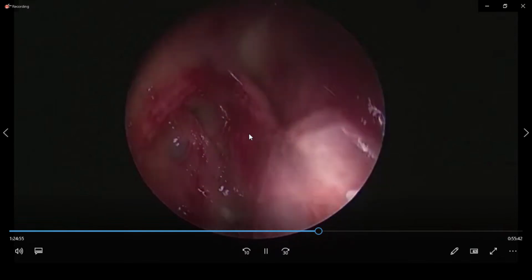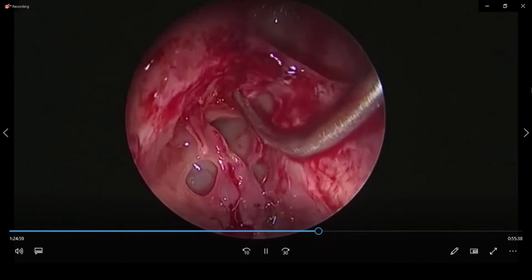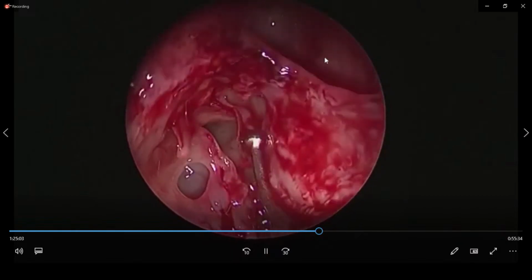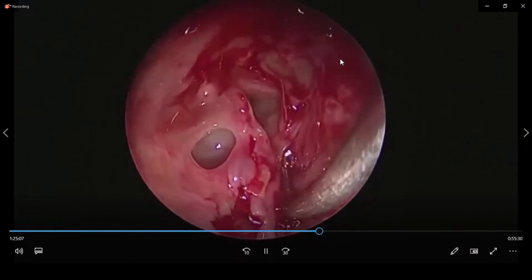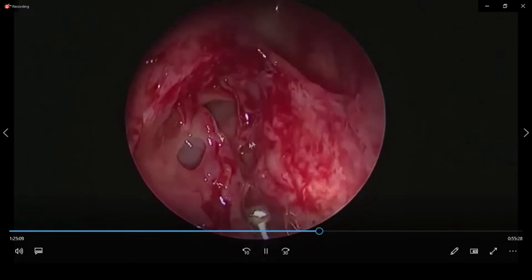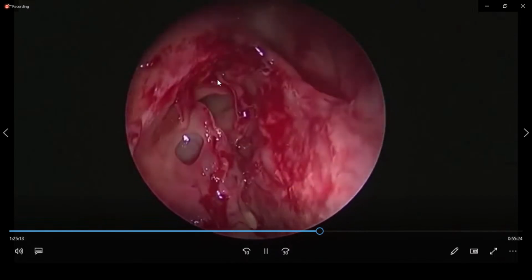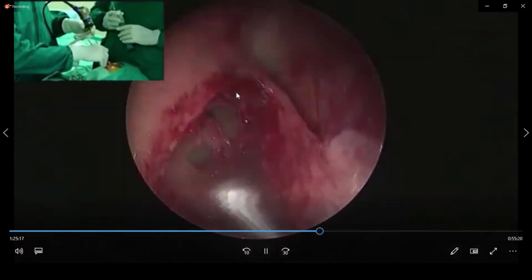What do you say? It looks like frontal sinus, but where is the frontal sinus? I told you on CT scan there are various cells. Supraorbital cells, type 3 cell. See, this is the type 3 cell above. Can you see this?